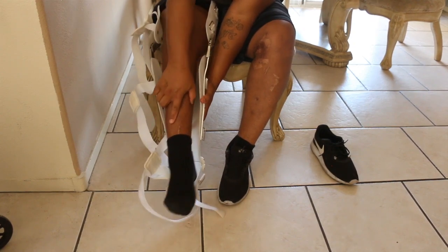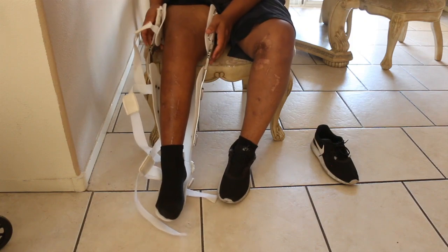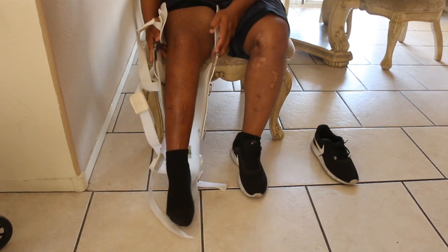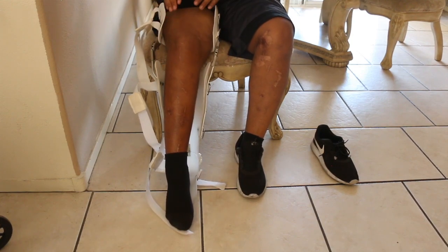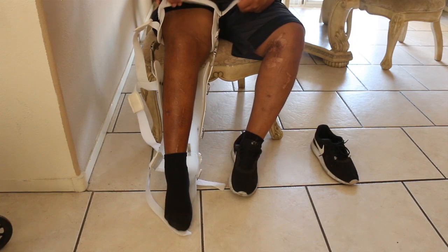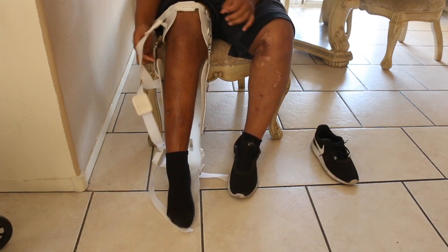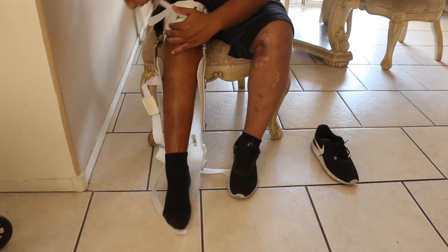The brace is really bulky — not too heavy, but just bulky. I think they make it so big so that you don't have to go back to them if you gain weight. But other than that it's pretty bulky. You can squeeze it to make it fit your thigh and legs, as you'll see me doing.